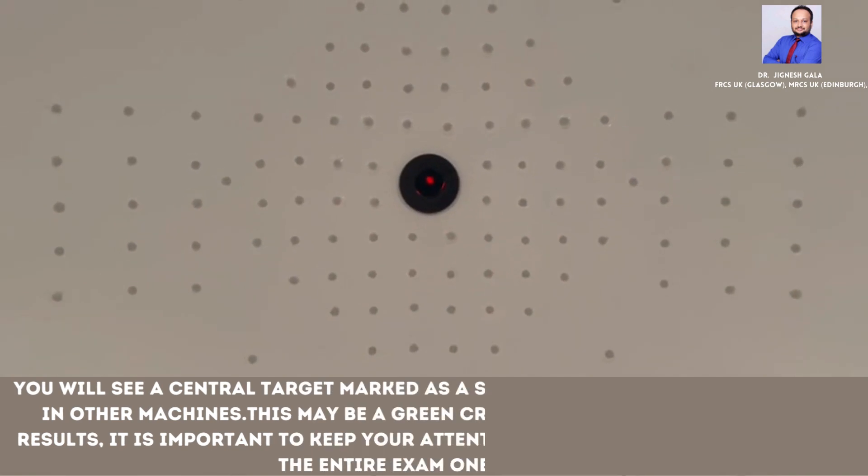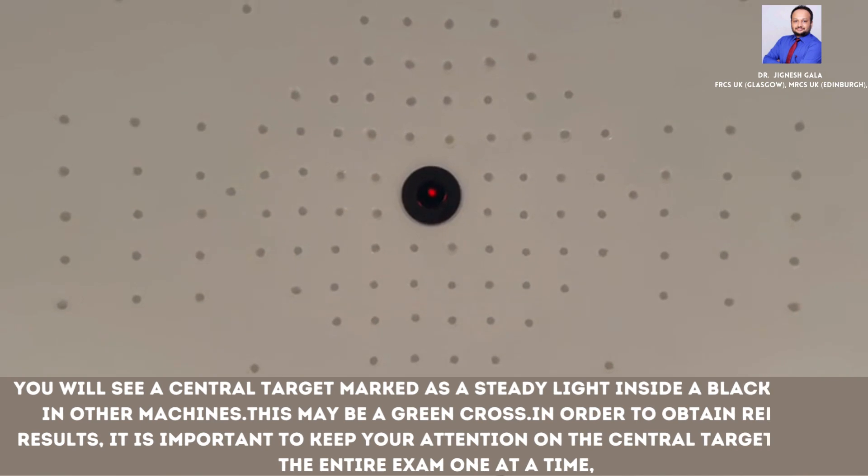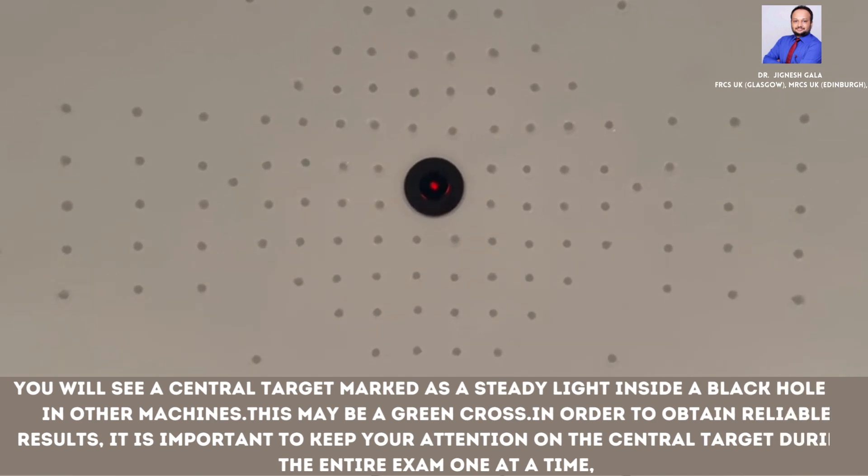The central target may be a green cross. In order to obtain reliable results, it is important to keep your attention on the central target during the entire exam.